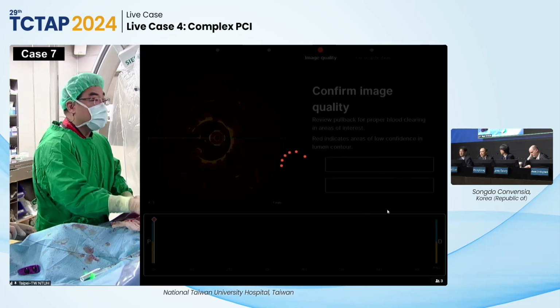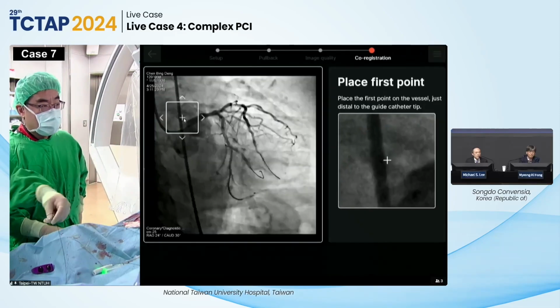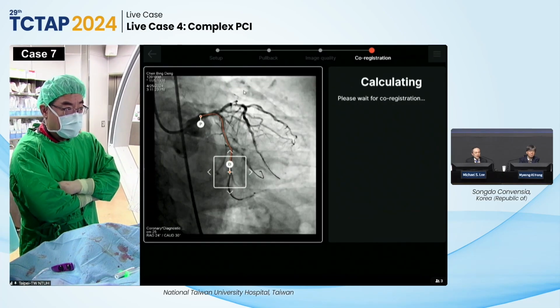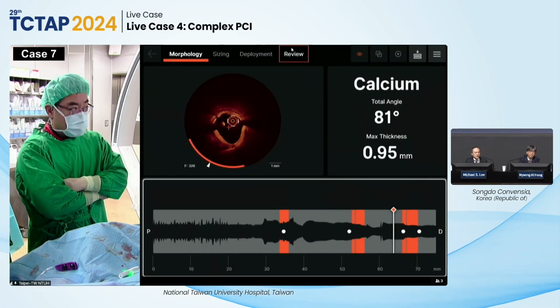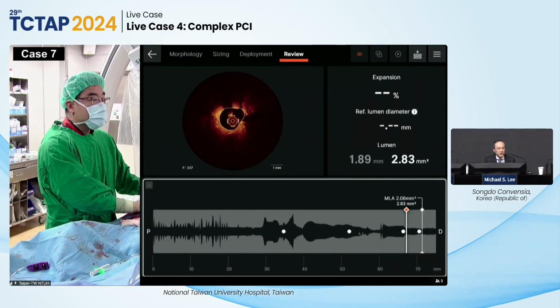Can I play devil's advocate, Dr. Kao? Yes? This is an 85-year-old male where he has distal left main disease. In the grand scheme of things, treating the distal circumflex, he's not going to have a mortality benefit from that, but he will have a mortality benefit from just treating the distal left main. Right, and just leave it, keep it simple. That's just a consideration.